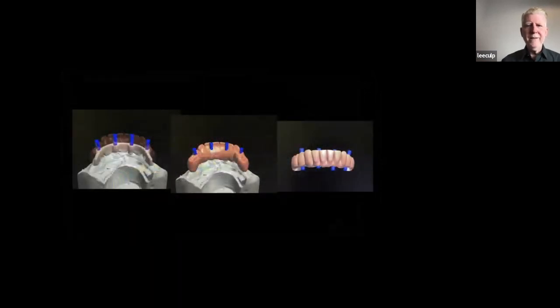And then I designed teeth on top of the bar. I bridged them, and then one of the techniques you use to make temporaries and other things, cut to gingiva. So I put the teeth where I want them. I cut to gingiva. It cut them from the bottom so it fit perfectly back on the bar. And then we milled out the teeth and bonded it to the bar and added a little tissue composite to the front. This is where monolithic dentures started, with this case right here.